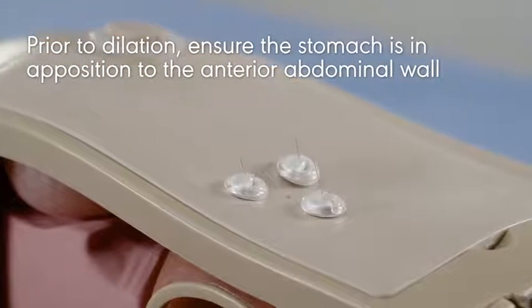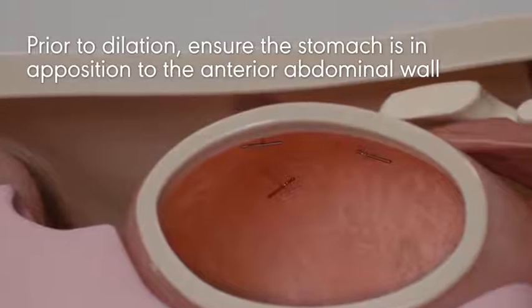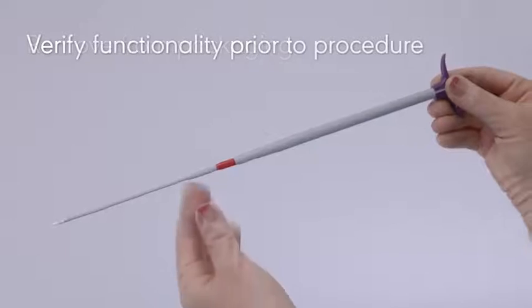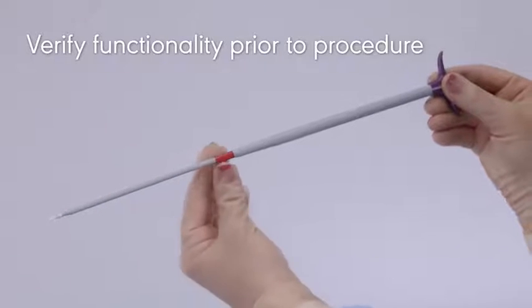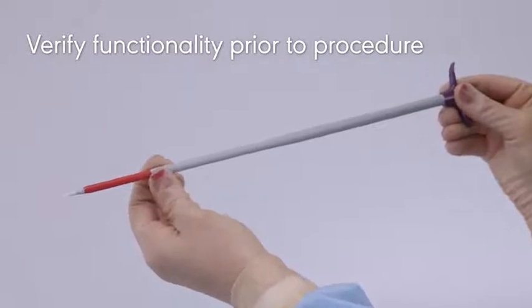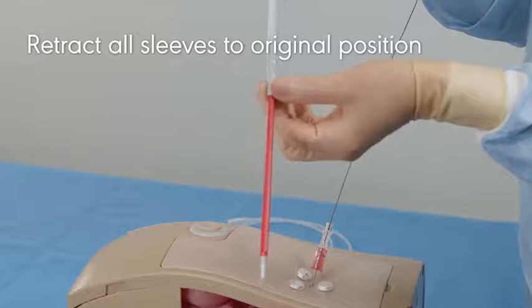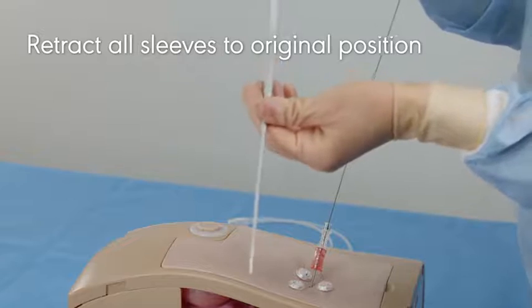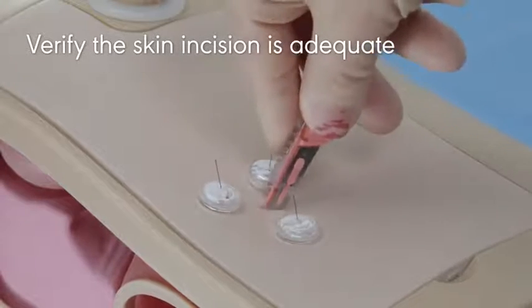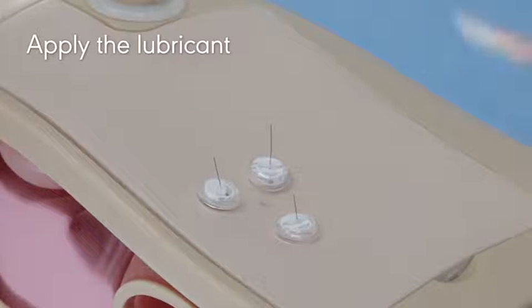Prior to dilation, ensure the stomach is in apposition to the anterior abdominal wall. Remove the dilator from the packaging. Verify functionality prior to the procedure by advancing each dilator sleeve distally until the physical stop is felt. Once verified, retract all sleeves to their original position. Verify the skin incision is adequate to accommodate the peel-away sheath. Apply water-soluble lubricant.